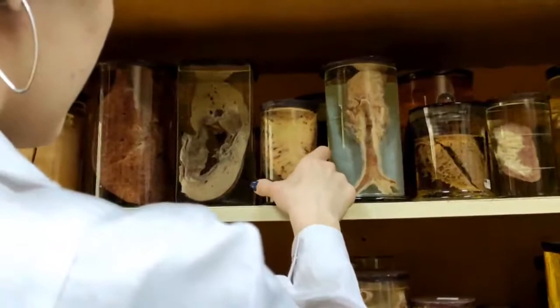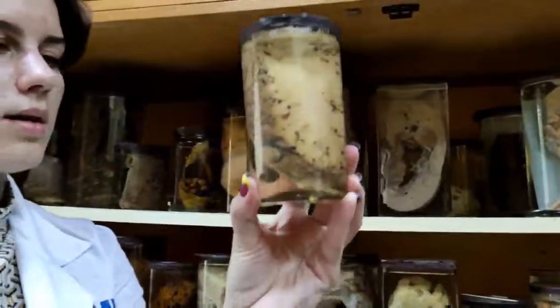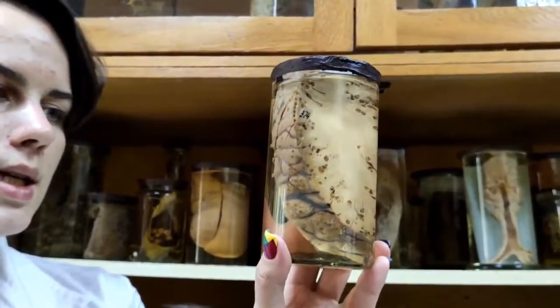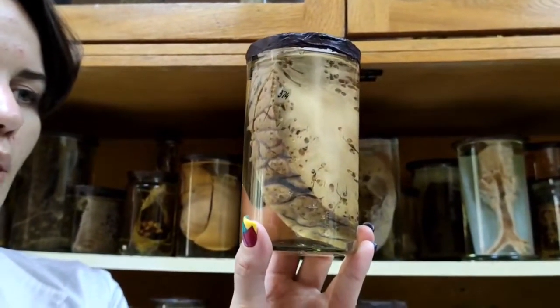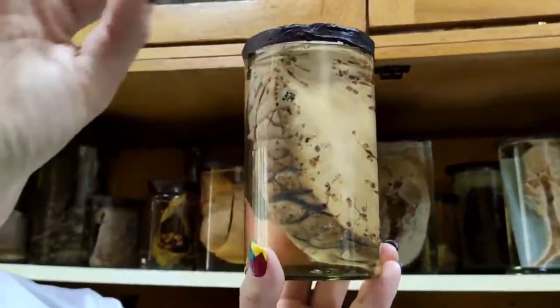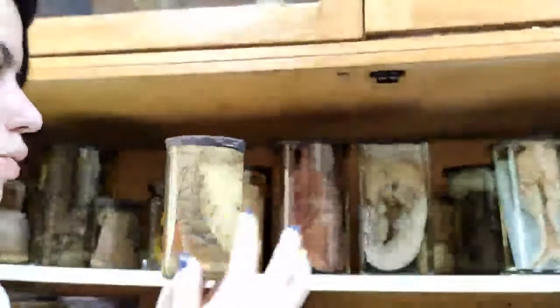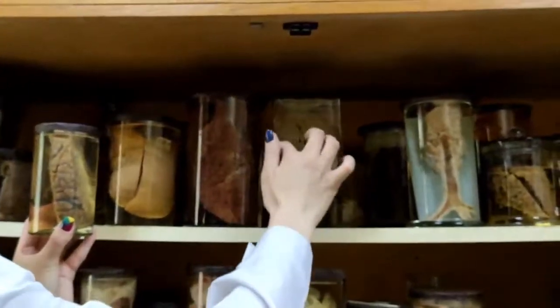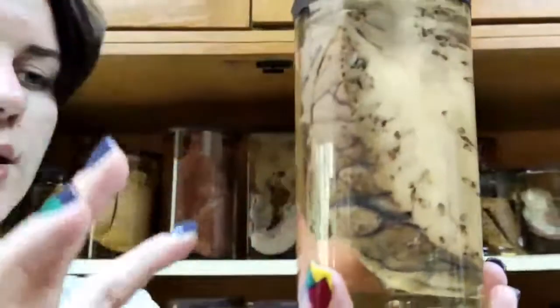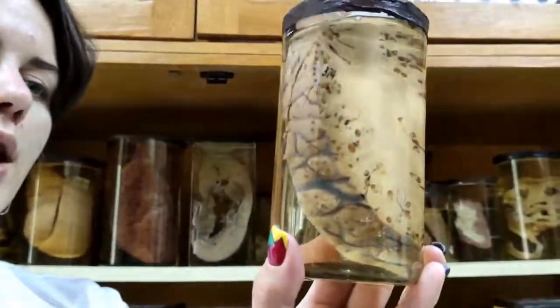The next specimen is cysticercosis. This is a disease where we also see multiple cysts, but this time not one cyst with a lot of secondary cysts inside like here, but just diffuse cysts in the parenchyma of the brain.